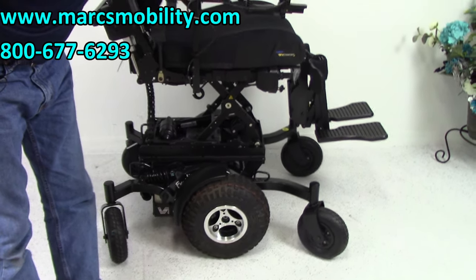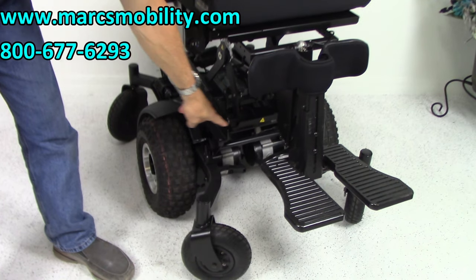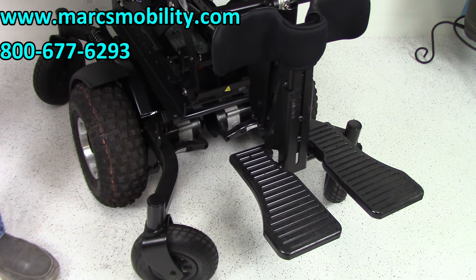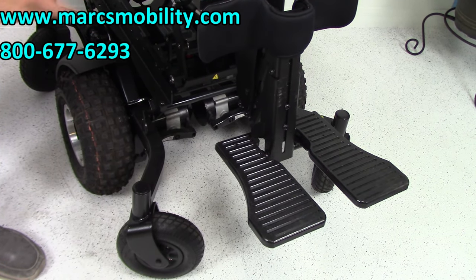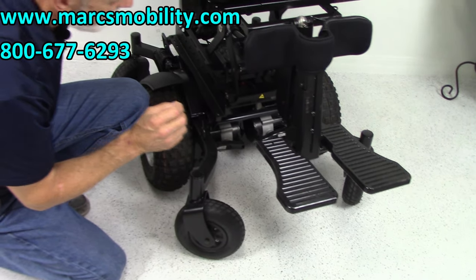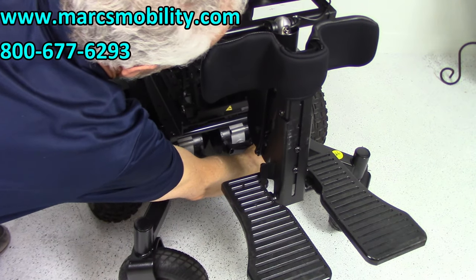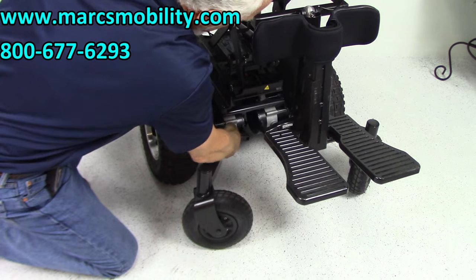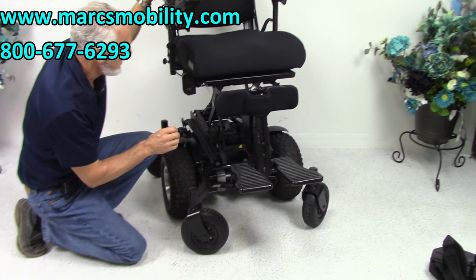You can actually see the two motors in the front — those black cylinders are 800-watt motors each, for a total of 1,600 watts of power. They're inline motors that go directly to the wheels — heavy-duty motors. If you need to put the chair in neutral, each motor has a lever in front. Push it down and the chair is in neutral; push the lever up and the motors are back in gear.